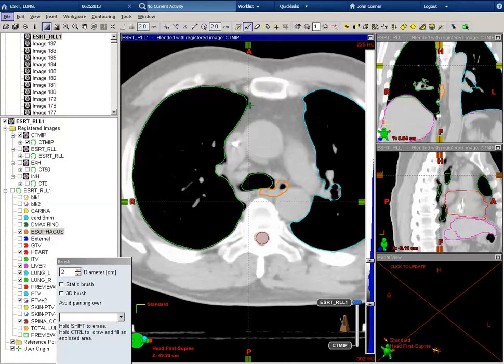We'll contour the spinal cord down to the bottom of the L2-L3 interspace.